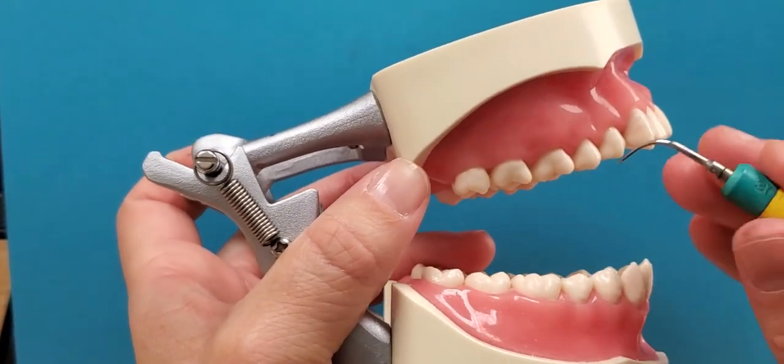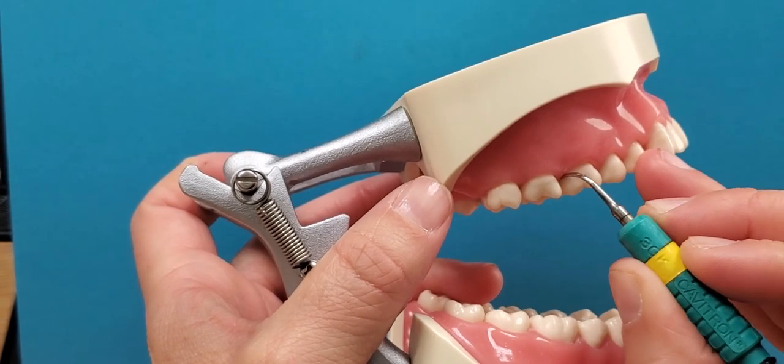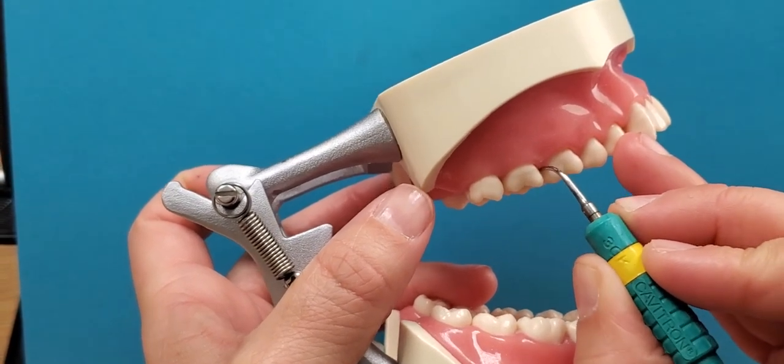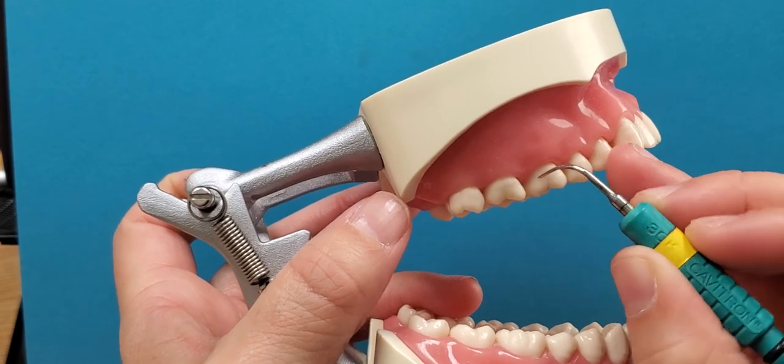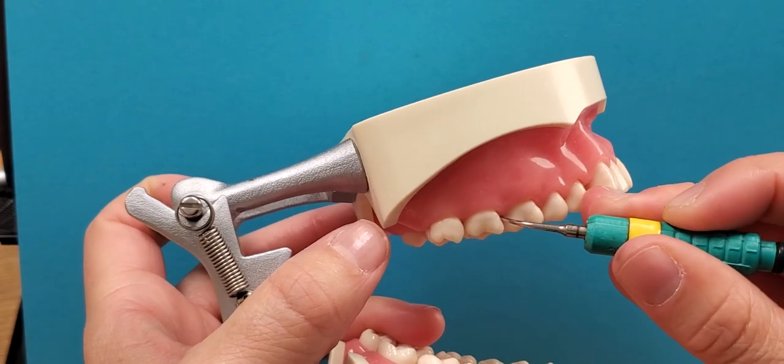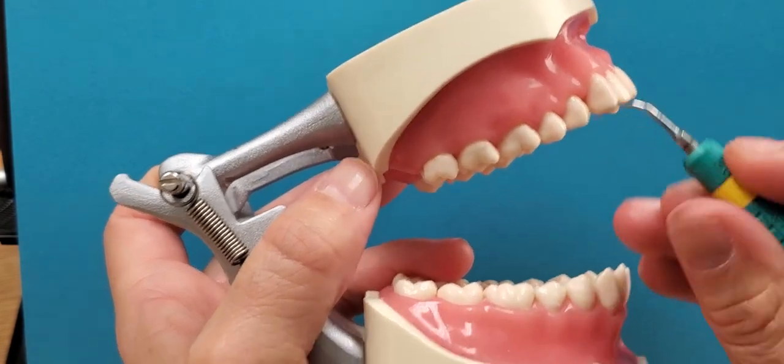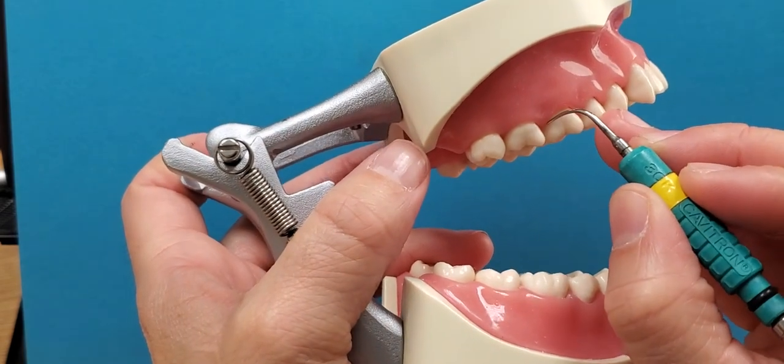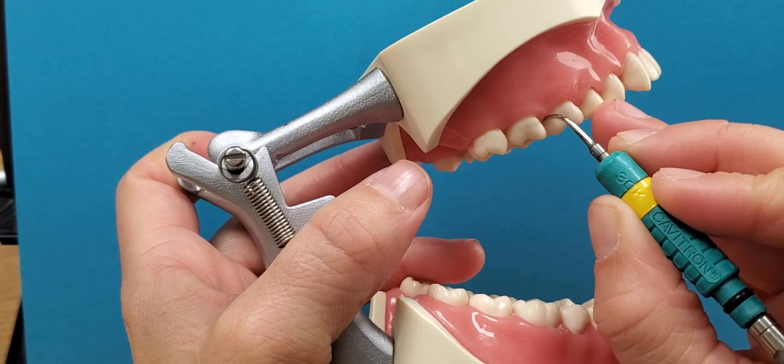When you are using curette style instrumentation you need to remember that you want to keep the lateral sides of the instrument on the tooth. Sometimes we see people position the instrument this way, and if you do this then you have the face of the instrument adapted to the tooth. So with curette style you want to keep lateral side against the tooth.